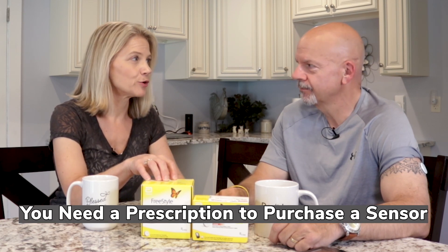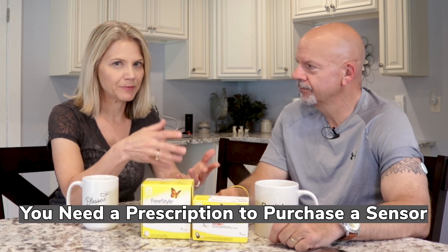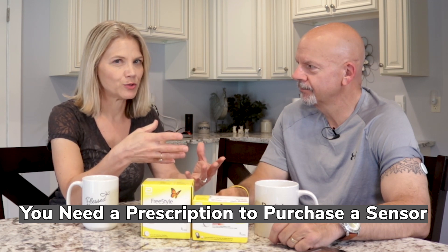This is a system that is available to anyone if you get a prescription from your doctor. Diabetics are probably the ones who would utilize this the most, because it allows you to just take a reading with just a swipe. So we've got a reader here, and we've got the sensor.